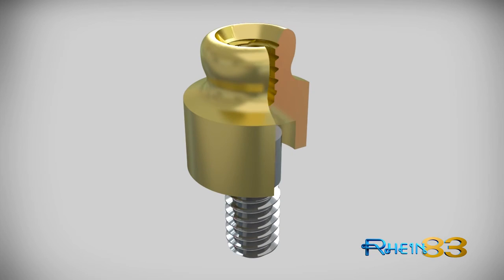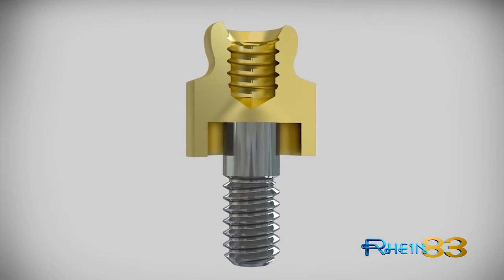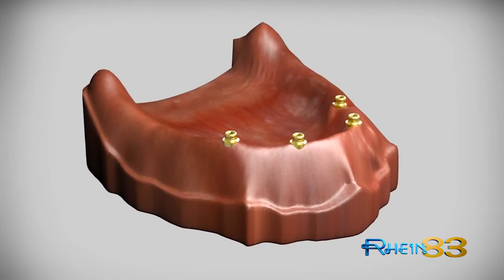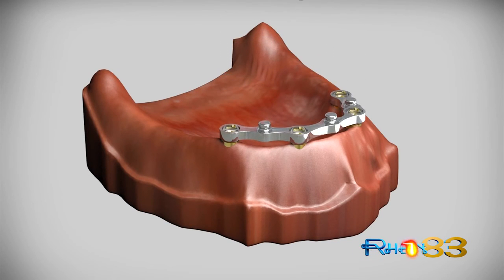The internal thread allows the OT Equator to be connected passively for the construction of a cast or milled bar, due to the elastic Seeger system. The passive insertion of the bar is possible even in cases of extreme divergence between implants, simplifying the technique used with traditional MUA, compensating any small imperfections arising during the clinical or laboratory procedures. In addition, the OT Equator offers a threaded CAD CAM version to be screwed directly into a milled or cast bar.